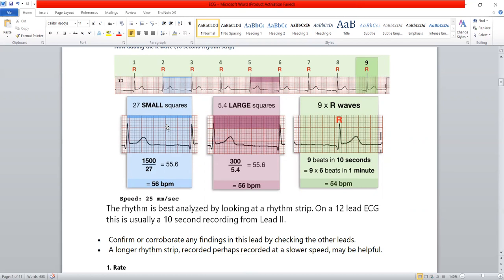The total number of small squares in one large square is 25. But when we refer to the time scale on ECG, we only count the small squares present on the horizontal line — that is 5 small squares from one bold line to the next. For time measurement, only those 5 horizontal small squares matter, not all 25.